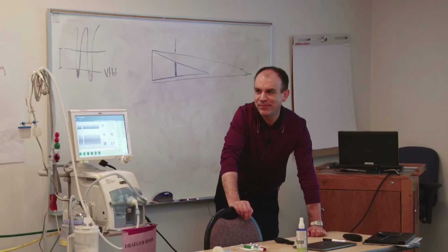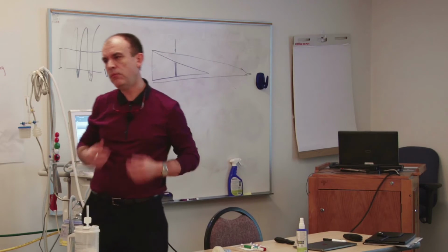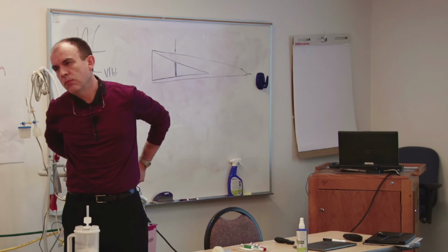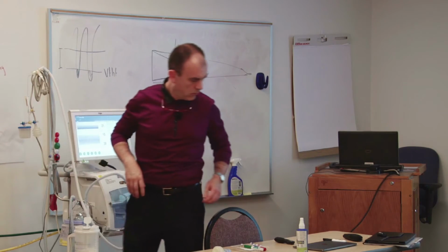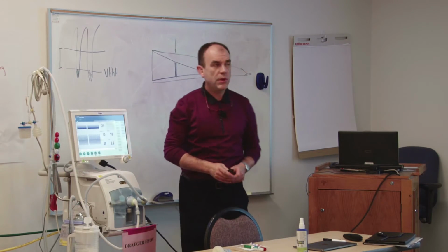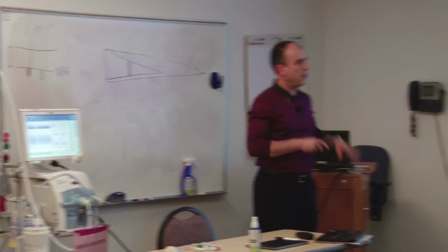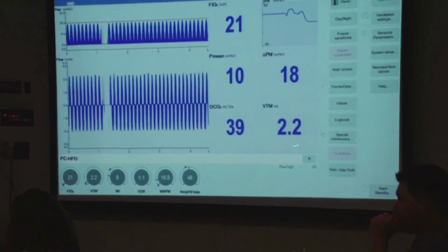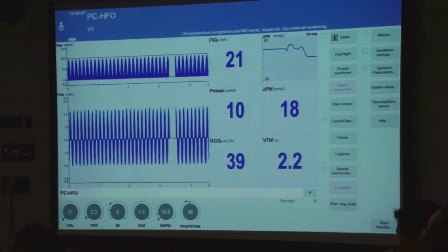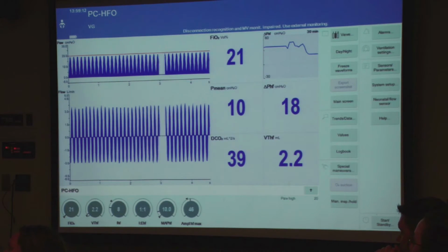So what happens if you have your baby on this setting, and now the baby's getting more edematous and your CO2's going up? What increments do you usually change your volume guarantee? What you can change are two parameters. If you remember the diagram we saw yesterday, if you want to increase ventilation or CO2 removal, what you will try to increase is VTHF.